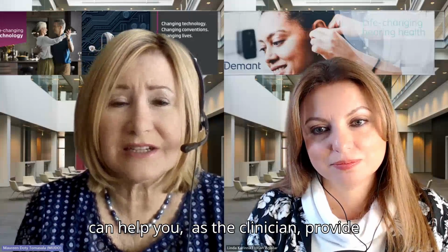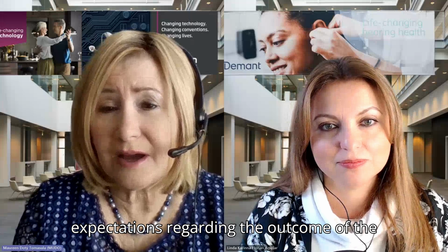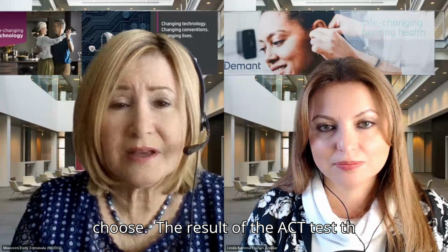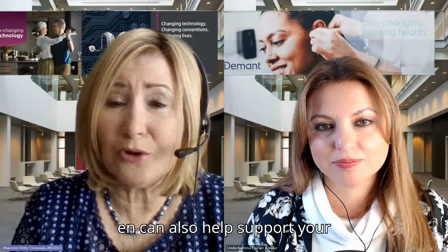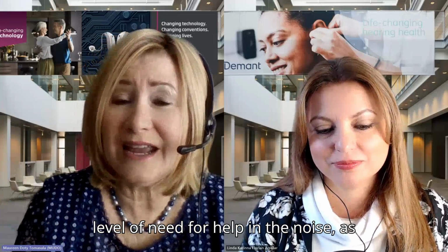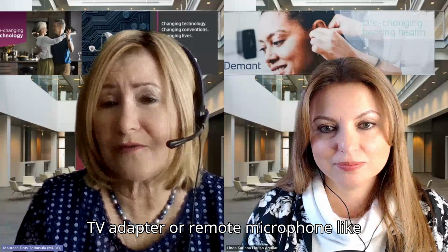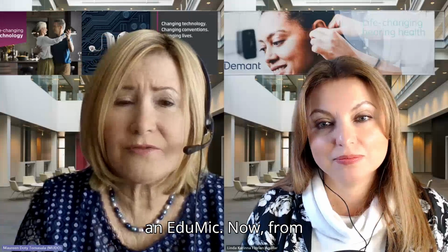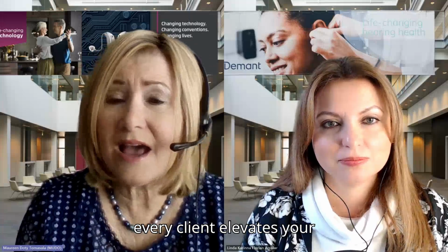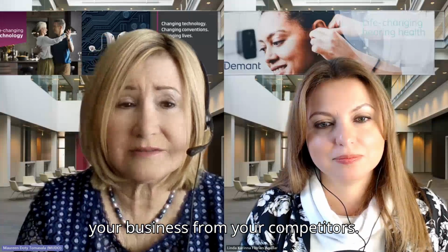This can help you as the clinician provide better counseling and also set expectations regarding the outcome of the hearing aid fitting and whatever technology level the client wants to choose. The result of the ACT test then can also help support your recommendation for a higher level of technology when the clients have a higher level of need for help in the noise, as well as maybe recommending things like a TV adapter or a remote microphone like an EduMic. Now, from a business point of view, including ACT in your testing with practically every client elevates your professionalism and truly differentiates your business from your competitors.